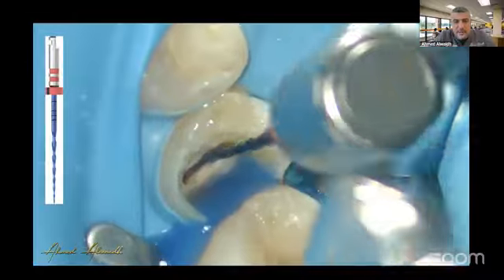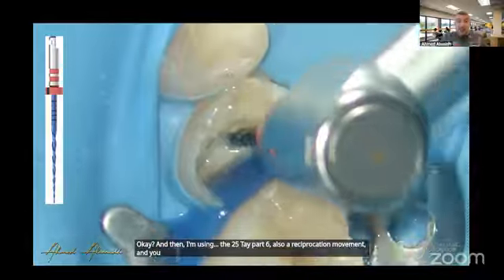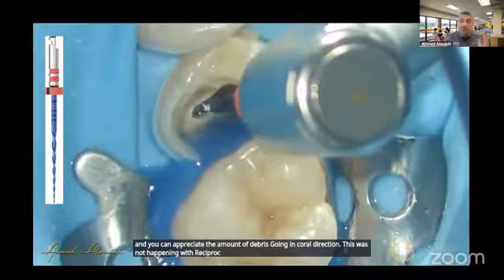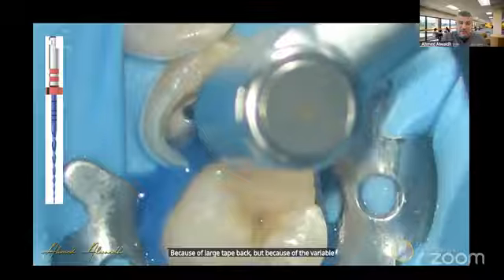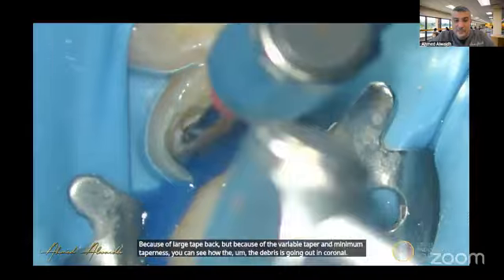And then I'm using the 25 taper 6, also with a reciprocation movement. And you can appreciate the amount of debris going in the coronal direction. This was not happening with Reciproc or WaveOne because of the large taper, but because of the variable taper and minimum taper, you can see how the debris is going out in the coronal direction.